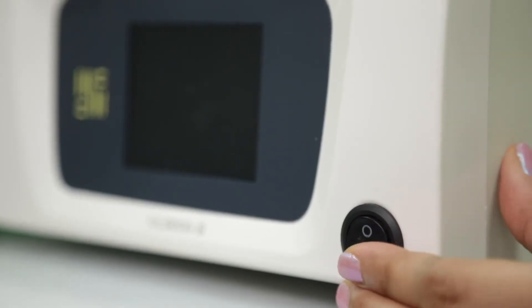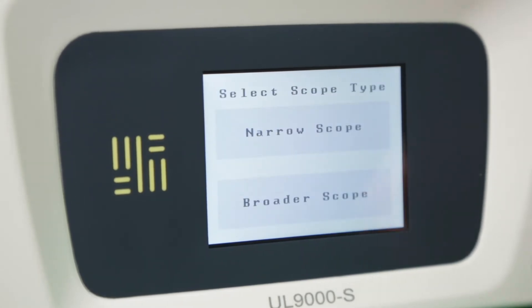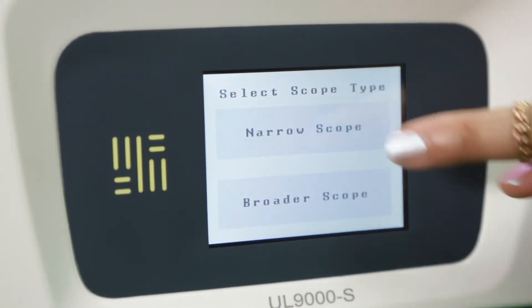When we switch on the unit, you'll see two options on the touch LCD screen: Narrow Scope and Broad Scope. Press Narrow Scope if you have a scope up to 5mm, and if you're using a 10mm scope, press Broad Scope. This safety feature avoids damaging your scope due to high intensity of light in narrow fibers.